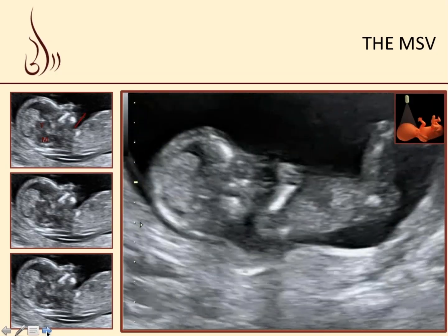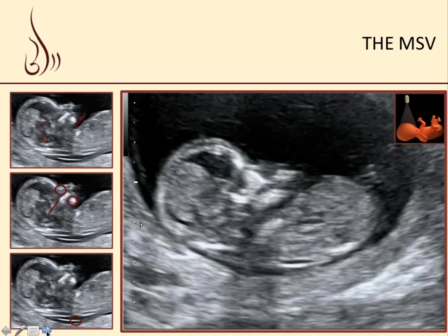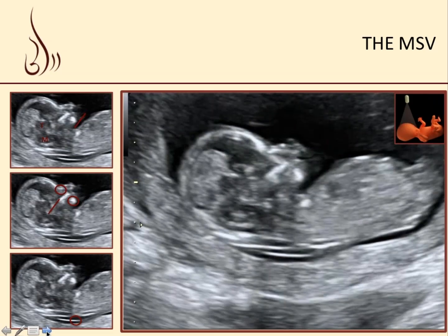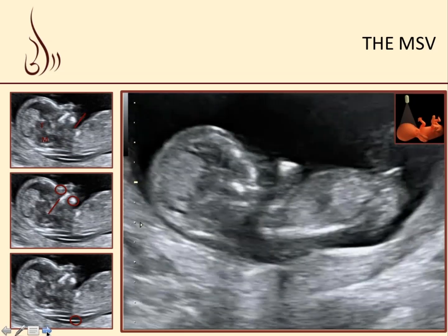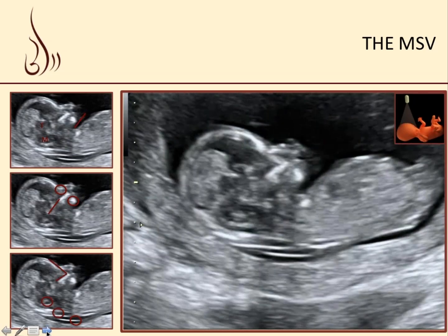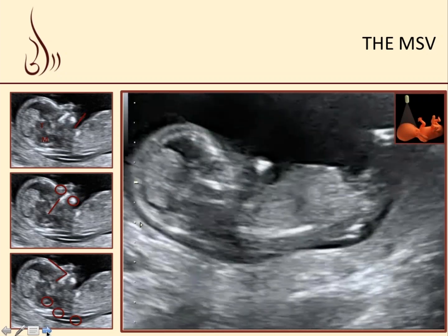It's important to see the nasal bone, the mandible, and to look for the palate and delineate the amnion from the nuchal translucency. And this is very important when you're measuring the nuchal so that you don't erroneously get a large nuchal translucency. We can also see all the landmarks we talked about with respect to the intracranial translucency and the nuchal translucency as well.